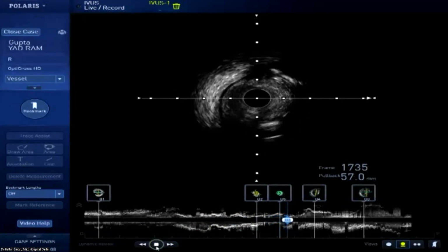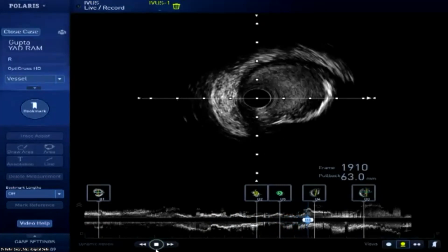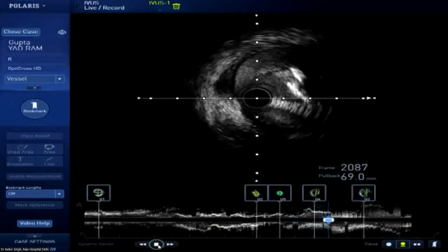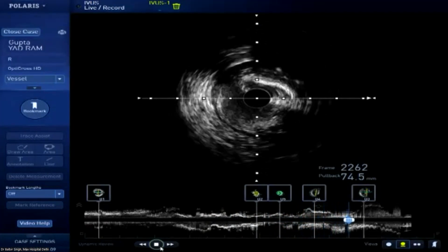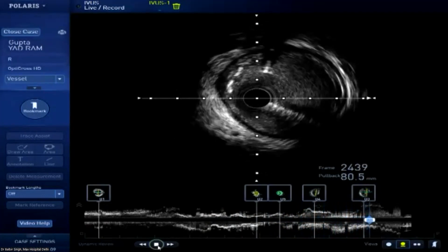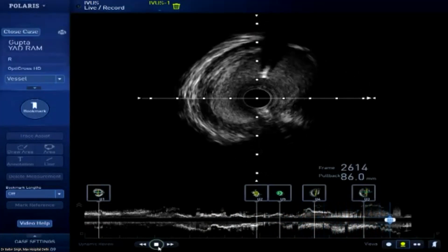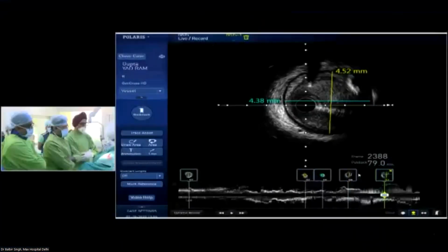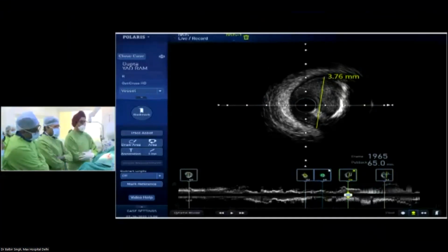Are you telling us that right at the left main, at the very end of the IVUS run, we at least got the impression that there was almost a 360 calcific segment that is probably just proximal to where your dissection in the left main is in the LAD? So I don't know, are you also interpreting that image similarly, or am I not seeing correctly? No, I would show you the OCT. There's a calcified nodule. Again, we saw calcium, but it is not... You see this calcium in the distal part of the left main. Can you go to that? It's an arc on one side. This arc is a calcified nodule on OCT.